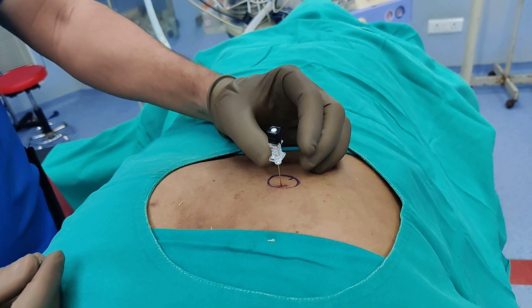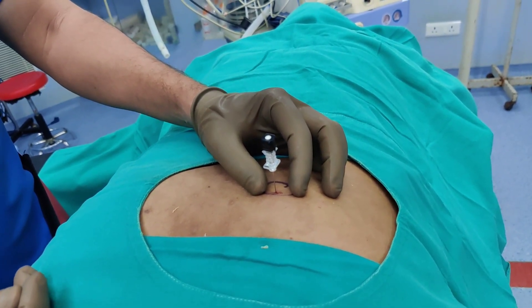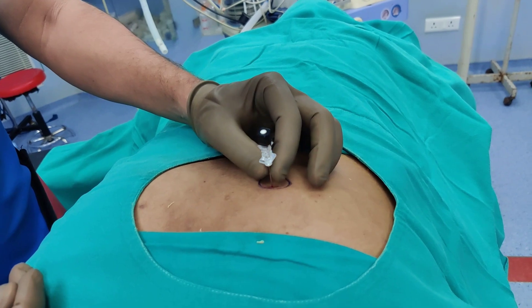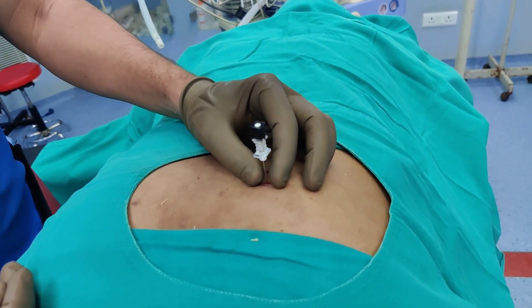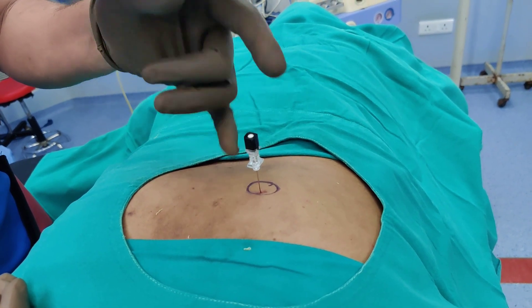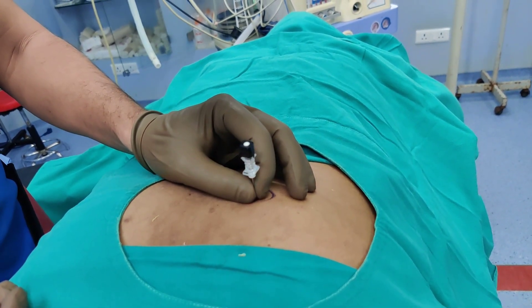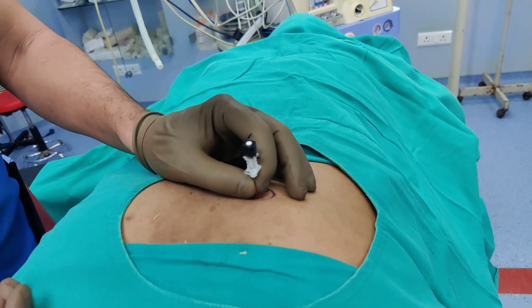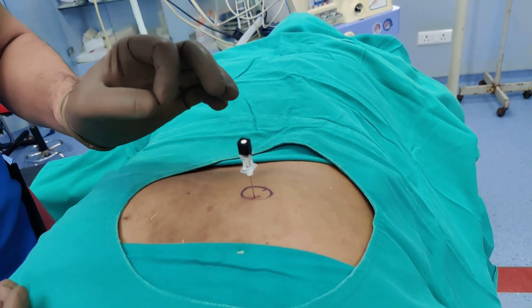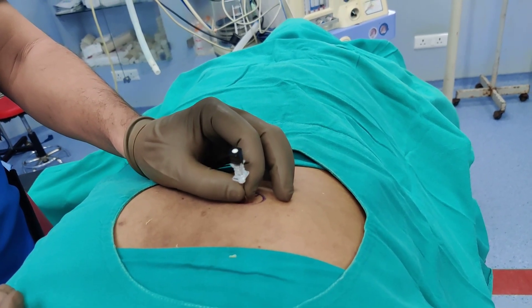This particular patient is quite obese so a lot of needle has gone inside — in thin patients it won't be that difficult. Keep going in, and because your C-arm is perpendicular, just follow the track of the C-arm and you will end up in the joint. You will feel a give-way when you enter the joint. On this occasion I felt a give-way and I think I'm in the right place.